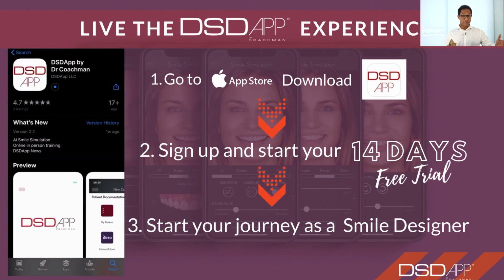And throughout this webinar, I will guide you on how you can understand the principles of smile design and everything else that you need to know to become a top smile designer in your clinic.